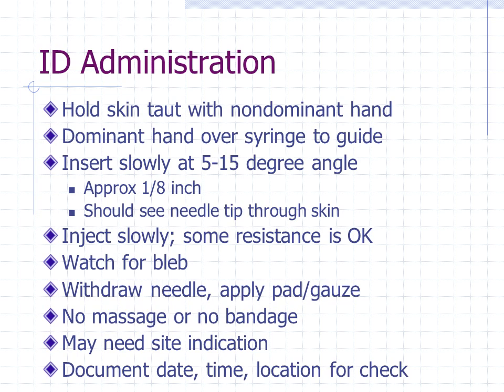You may need to draw a circle around the site. If it needs to be checked later, sometimes this is done.